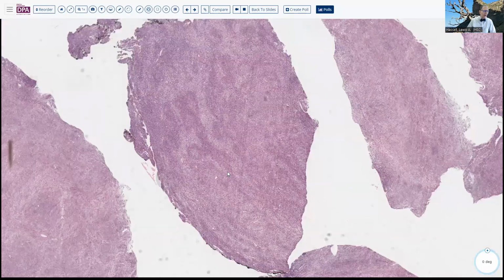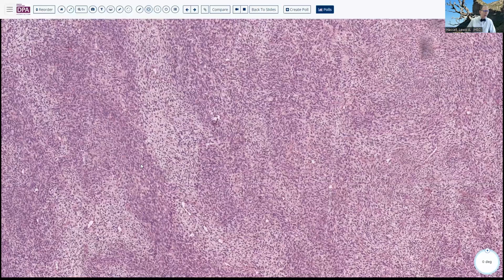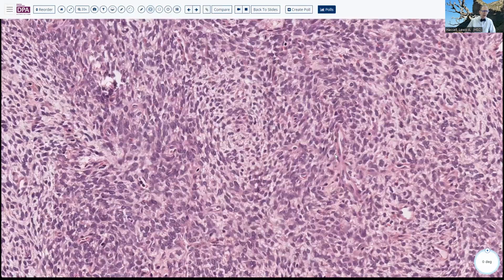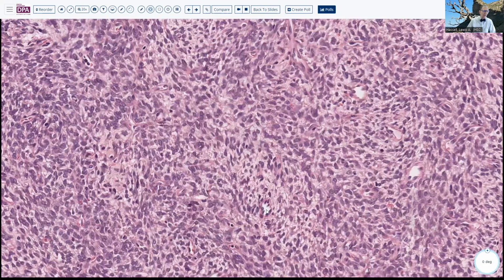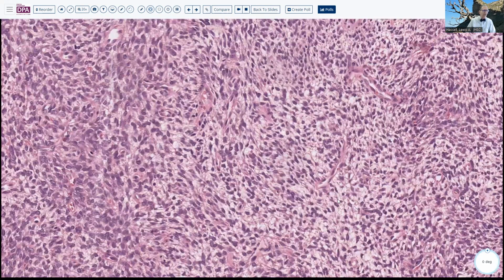Here in this more variegated area, we can see that there's some spindle cell proliferation, some more pale areas, some more eosinophilic areas, a degree of small, delicate vasculature in the background, and fairly uniform nuclei, almost monotonous you would say, somewhat rounded to oval, but occasionally spindle-shaped cells here. So this certainly falls into the differential of a spindle cell lesion, relatively low grade, and so forth.